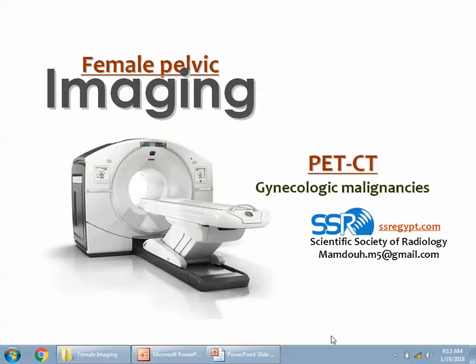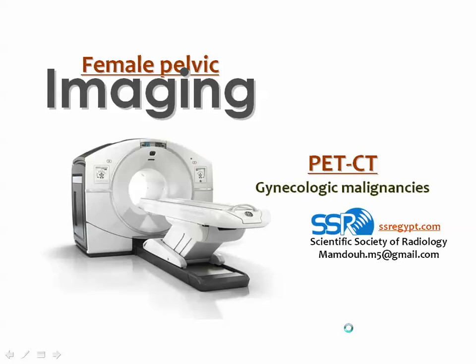Role of PET CT. Okay. The diagnostic value of PET CT in gynecologic malignancies.